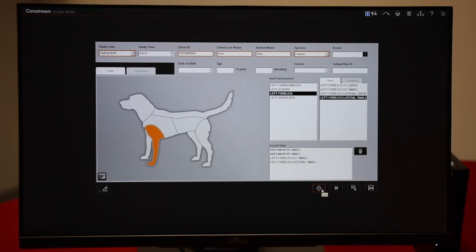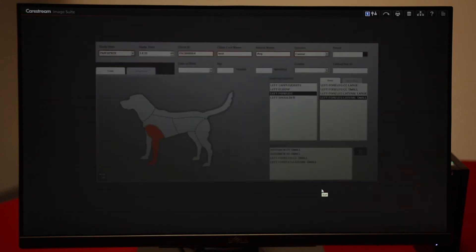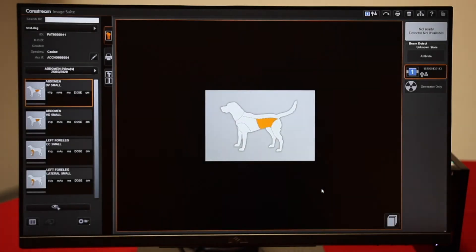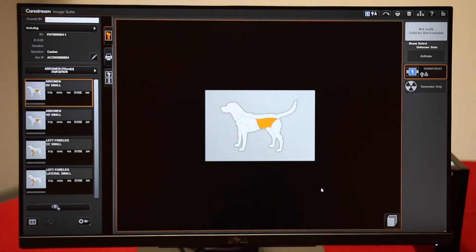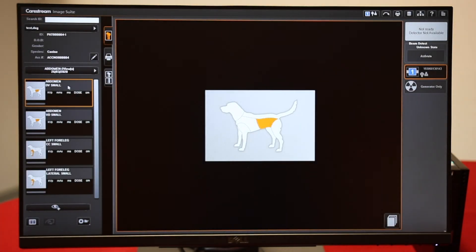We're going to go ahead and start. At this point, you can pick which view you're going to take first.